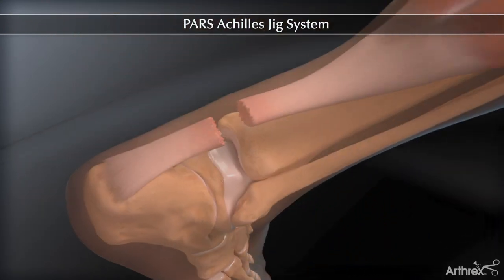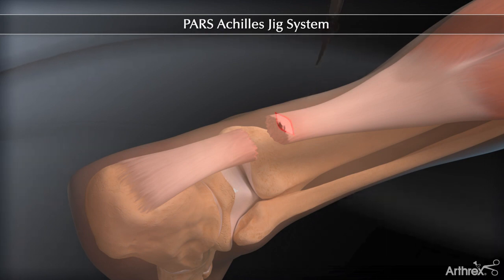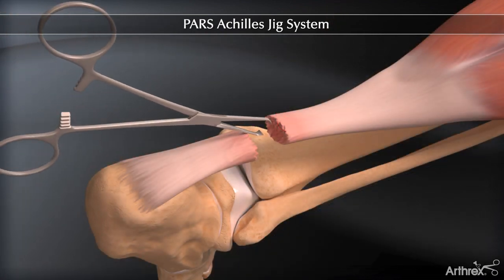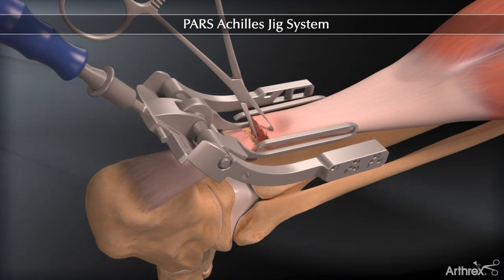A small incision is made one centimeter proximal to the palpable rupture in the Achilles tendon. The proximal portion of the tendon is grasped. The inner arms of the PARS jig are placed within the peritenon, and the jig is advanced proximally.